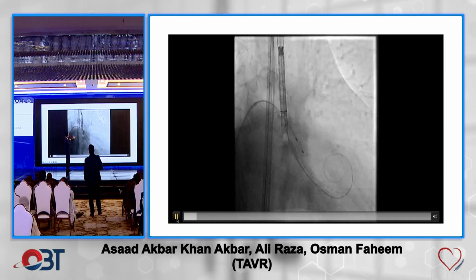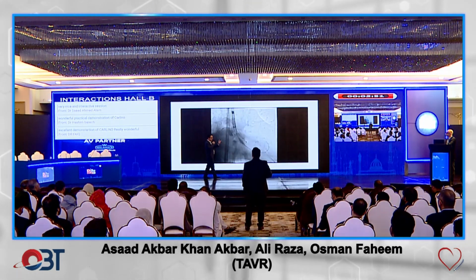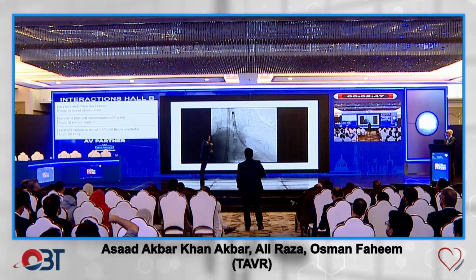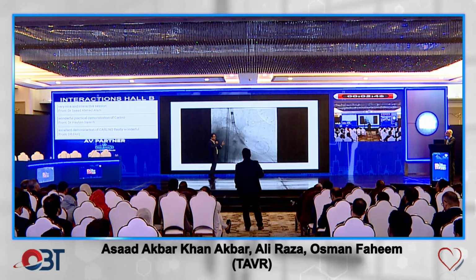So this is more like a cusp overlap, near cusp overlap view, because you see the LVOT is very horizontal. So they probably started with the near cusp overlap view. It's a near cusp, yeah. It's RAO and probably caudal as well. So this is the cusp overlap view. So just go back one slide.